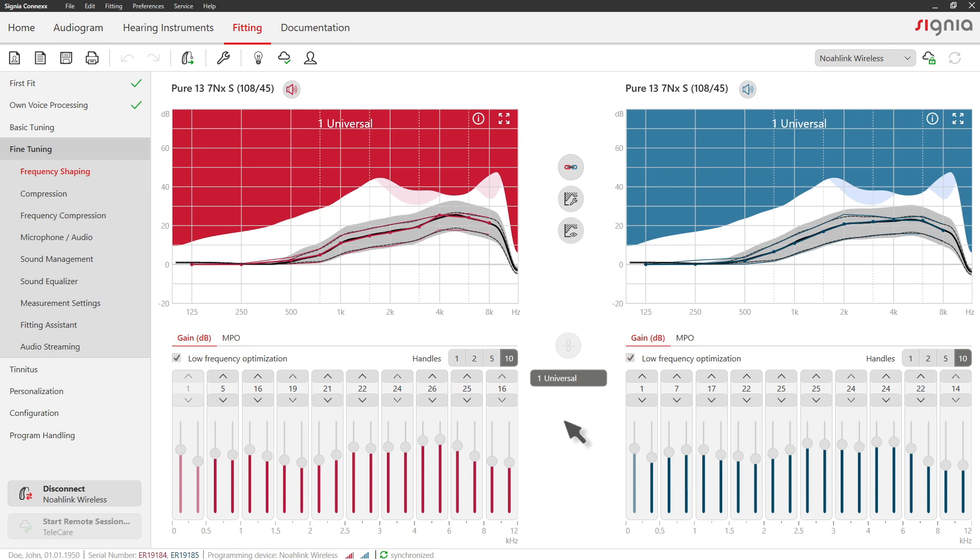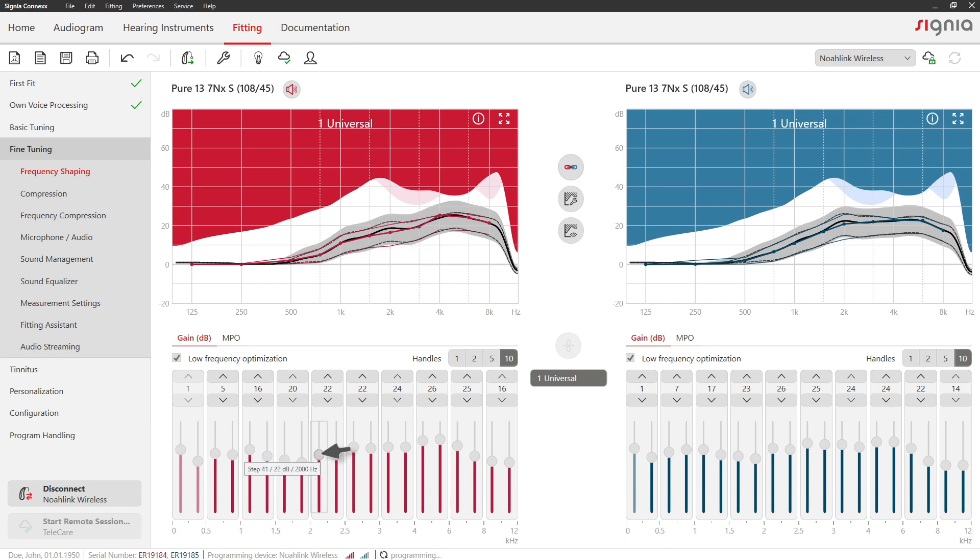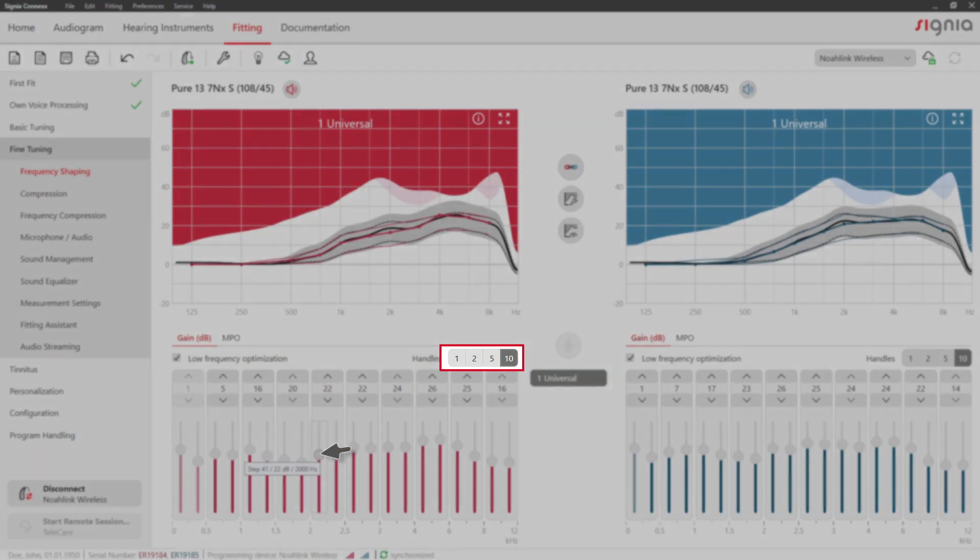In the Frequency Shaping tab, you can adjust overall gain and MPO in up to 20 channels. To make this easier, you can reduce the number of handles.